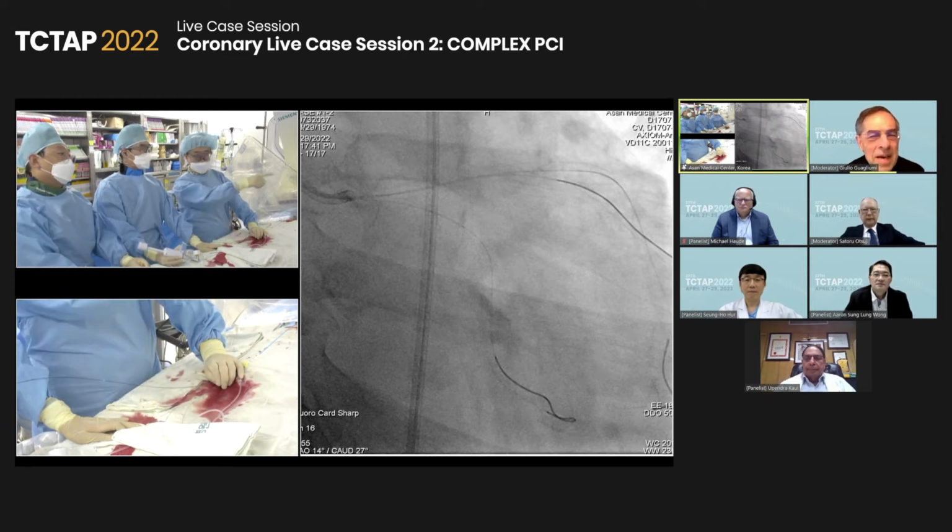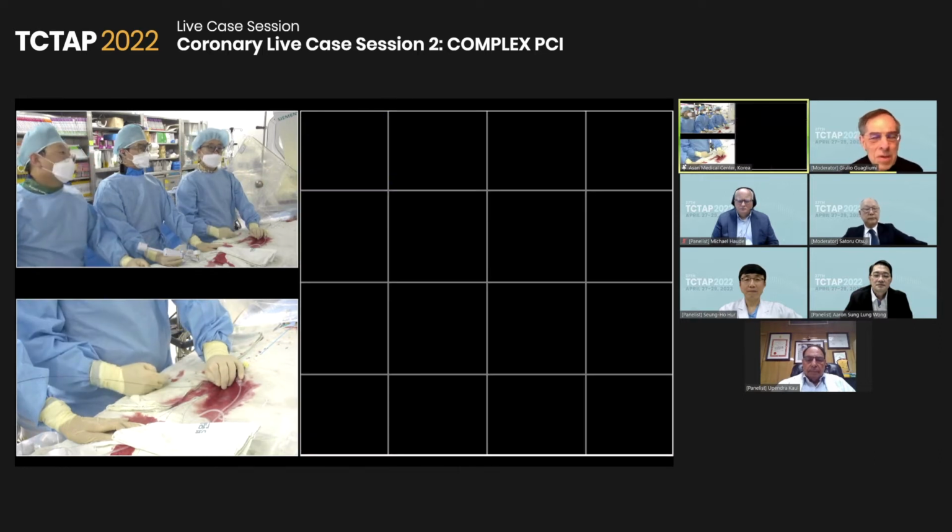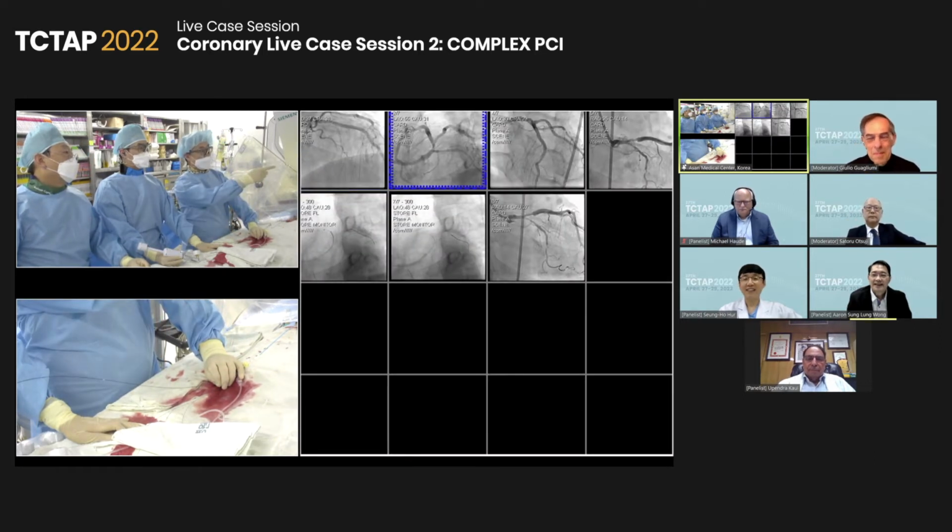Okay, great, please go ahead. We are following you. Come on. Okay, could you show us the angiogram?